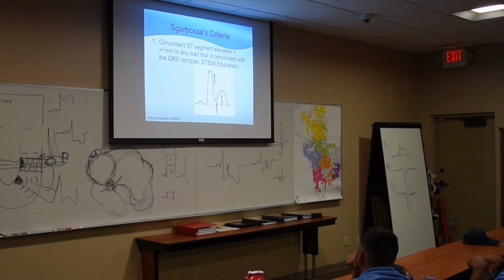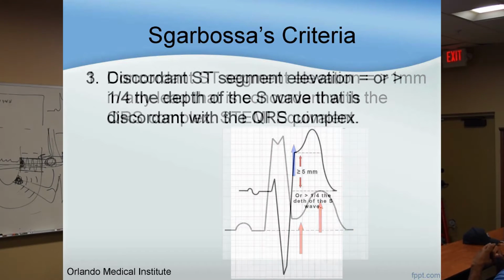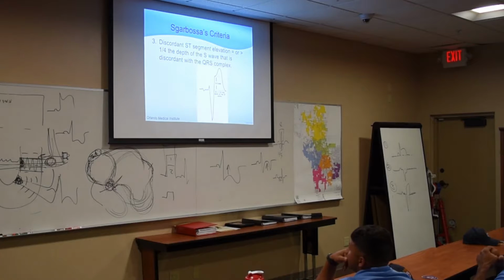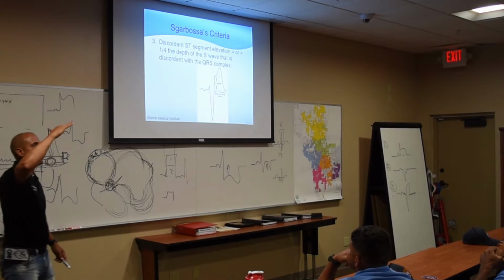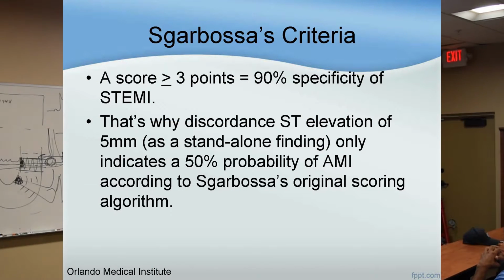So, moving on. ST elevation, concordant, we talked about that. ST elevation, concordant, below the isoelectric line, concordant, STEMI. If it's discordant, it has to be 5 millimeters or more. Compared to concordant, all it needs to be is 1 millimeter. So when you have discordant, let's look to confirm that it's 5 millimeters or more of elevation on the opposite side. If it's not, but it's close, let's say maybe it's 3 or 4, I'm going to do serial 12 leads to see if it increases. Once it hits 5, I'm going to call it. Because of the Sgarbossa criteria, as I mentioned, when it's concordant it's specific, and I said 90% of patients are having an MI. Those are good odds.